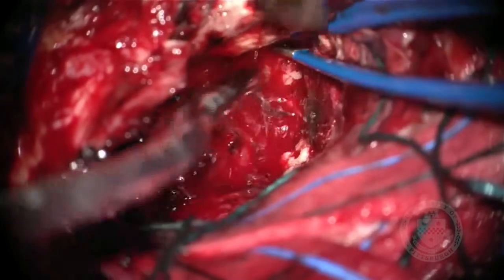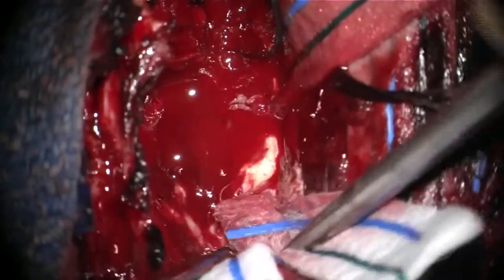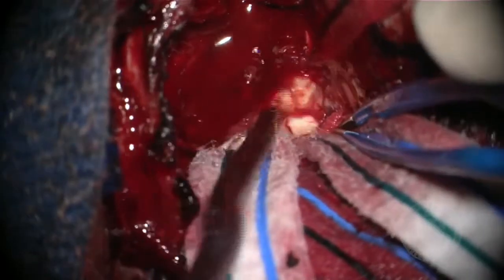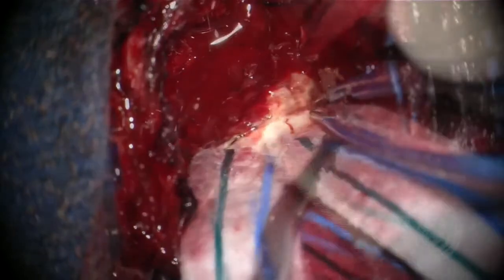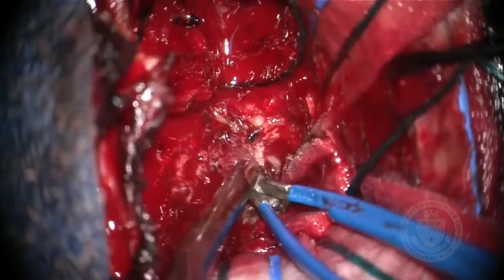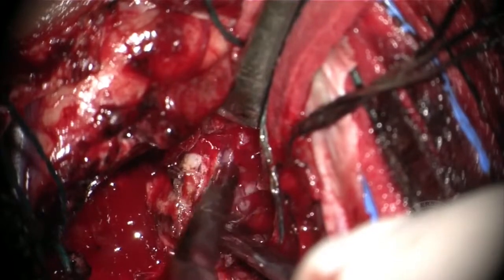We continue resection of the tumor anteriorly towards the hippocampal head and anterior aspect of the temporal horn. Now we are defining the posterior aspect of the tumor that is actually at the floor of the atrium. This is an ependymal vein. This is the body of the hippocampus that is completely infiltrated by tumor. We are now debulking the tumor that is within the body of the hippocampus.